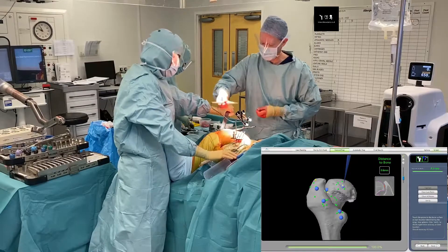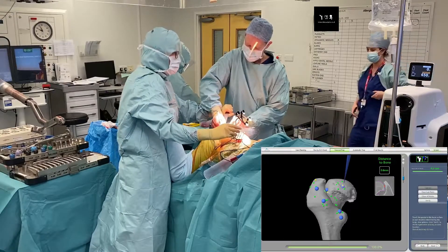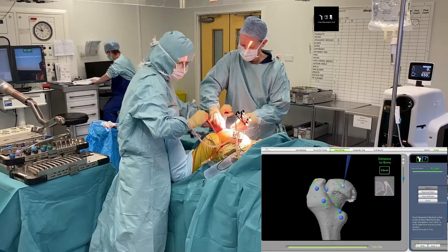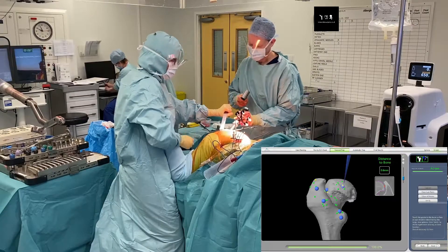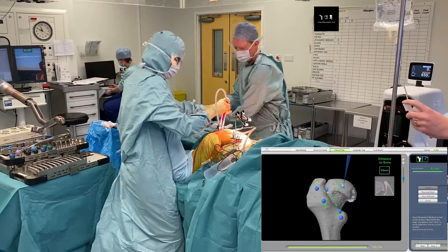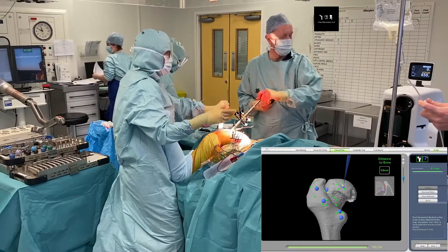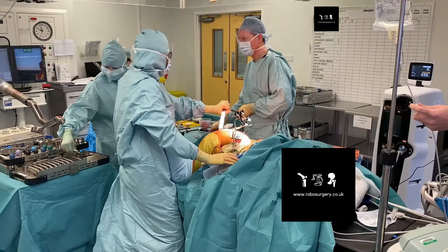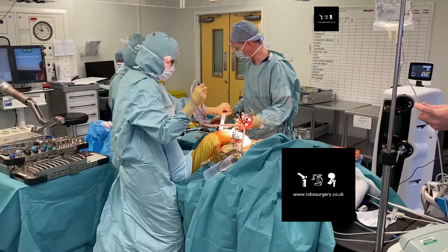In more complex cases such as congenital abnormalities or deformity of the proximal femur — perhaps a very short neck or excessive anteversion, both of which would be clearly evident on the pre-operative plan — we may choose to put a tracker in the proximal femur and reference the head-neck junction and the proximal femur to identify accurately the anteversion and any leg length discrepancy, which can be identified in real time so the robotic system will tell us exactly how far the implant needs to go in.